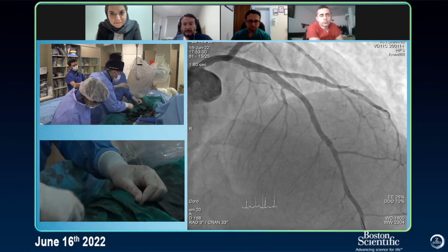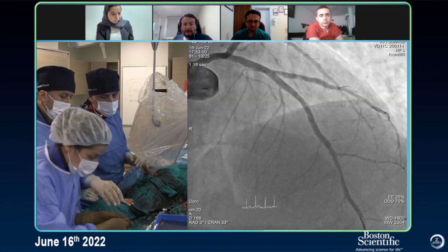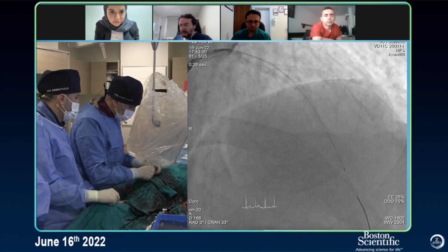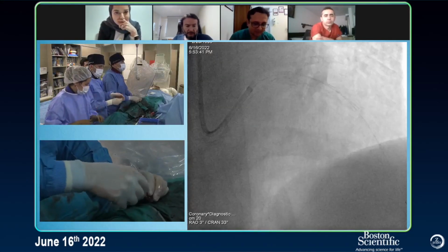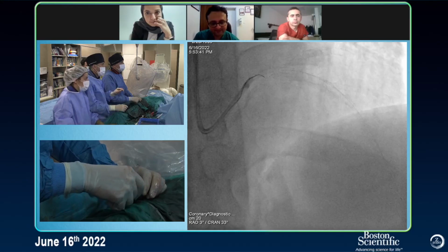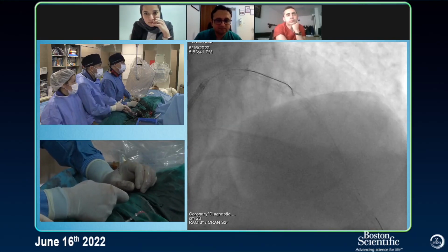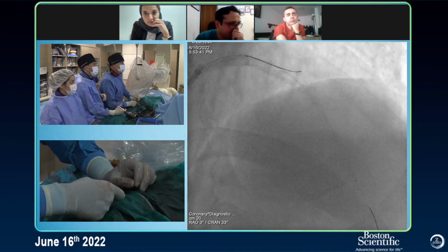Okay, let's have another wire and 2 balloon. And I need first a 3 balloon. We've got 15 minutes more. Hopefully we'll get to the end of this so you can finish. Okay, inshallah we'll do our best. This wire is a used wire, not a fresh one. It may take a little time to cross, that's why I'm saying that. Okay, nice.